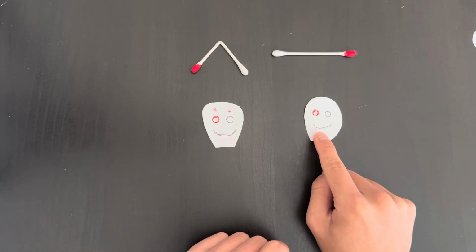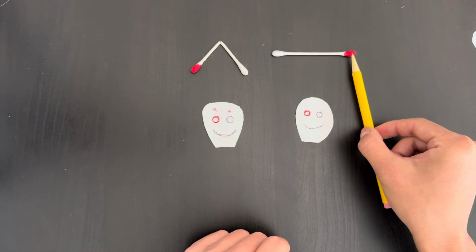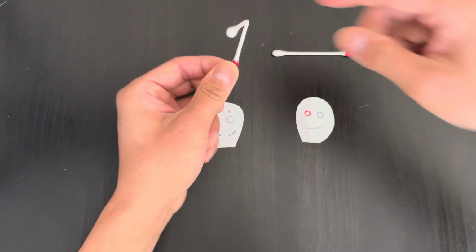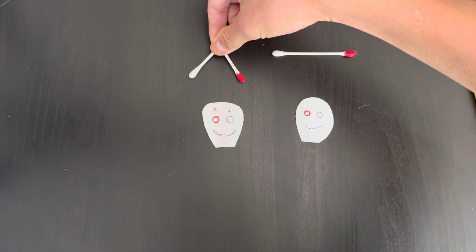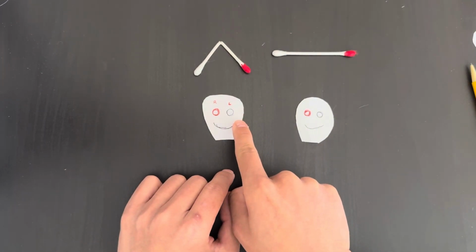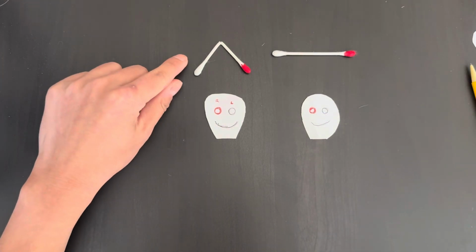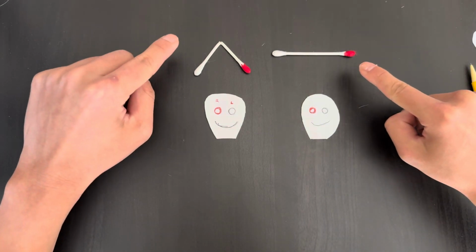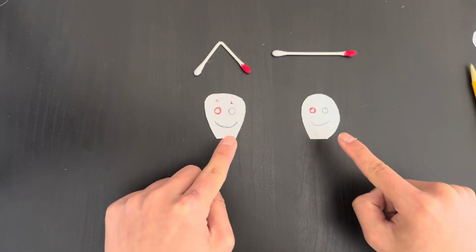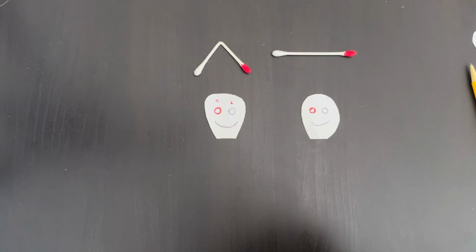So if I know this is my final product that I want to get, and the probe marker on my machine is pointing towards my right side, and thus the patient's left side, I would flip how I scan the patient so that I'm scanning with my probe marker on their left side, right? So now the machine is backwards, and I'm scanning them backwards, but because they're both in agreement, they're both backwards, the image turns out exactly the way I want. And this entire concept is what we're going to do for the heart, okay?